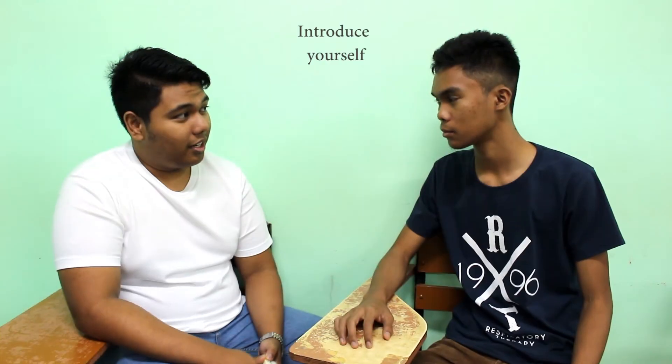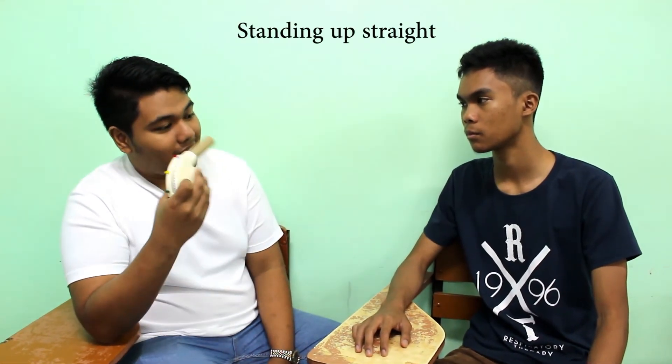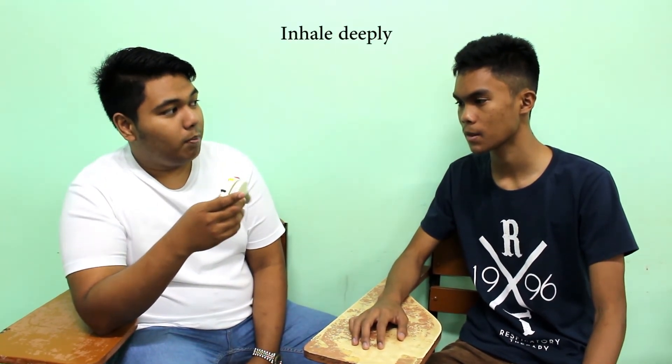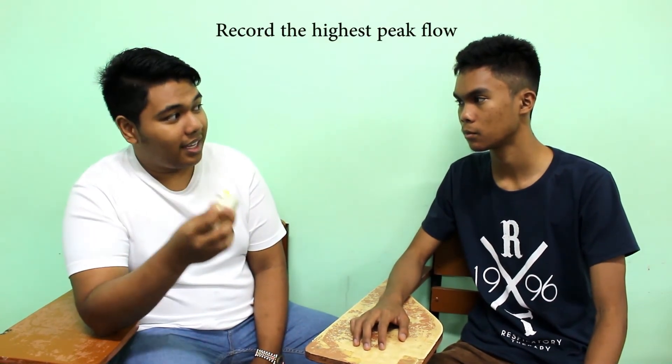Good morning, sir. What is your name, sir? Gendron. So sir, I'm going to explain to you how to perform the peak expiratory flow rate. The indicator will be set at zero. After that, you will be standing up straight. Place the mouthpiece in your mouth between your teeth. Do not block the opening with your tongue. Then blow as hard and fast as possible. You will do this two times and we will record the highest flow reading.